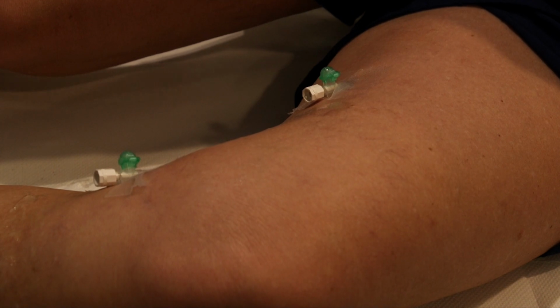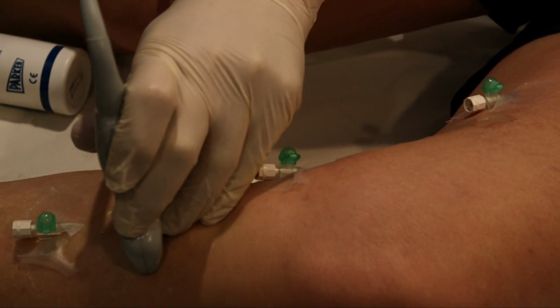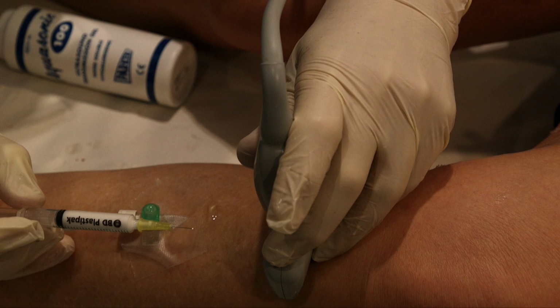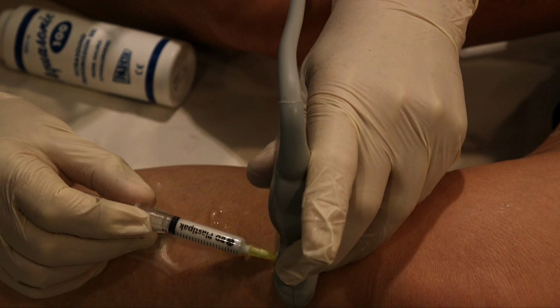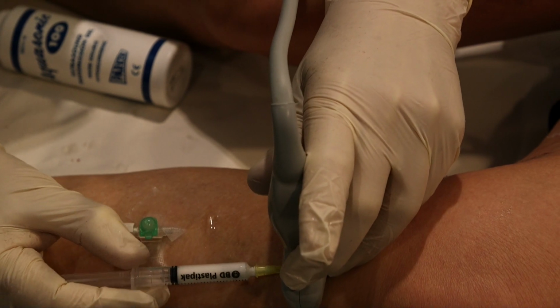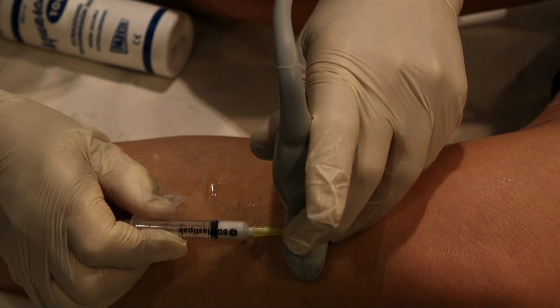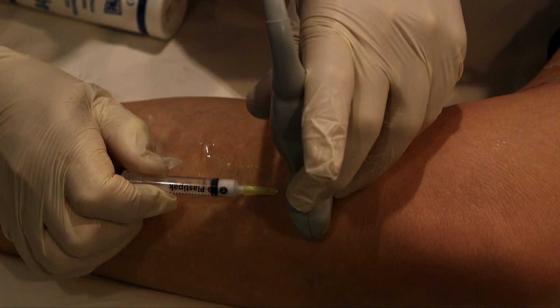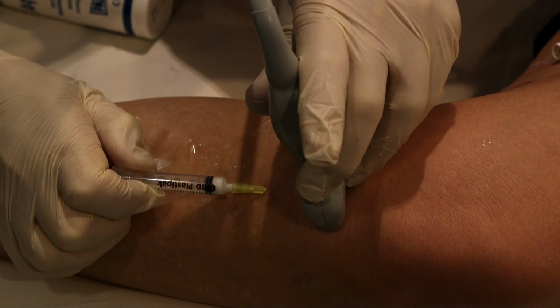Then we'll have a little go at the varicose veins down here. Somewhere around here there'll be straight enough bits that I can inject, like there. So another injection here. How's your leg feeling? Is it all right? Good. So just put the tip of the needle in that vein. That 30 gauge needle is 12 millimeters long, and quite a bit of that's in the vein, so that's a reasonably secure injection. You may get some aching as the foam goes into the saphenous veins proper, but usually it's only short-lived.